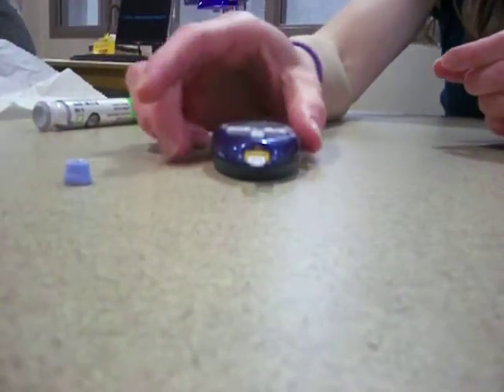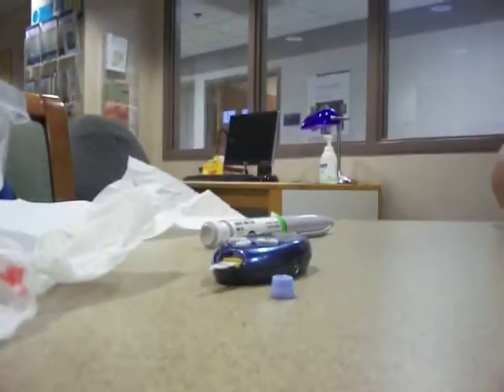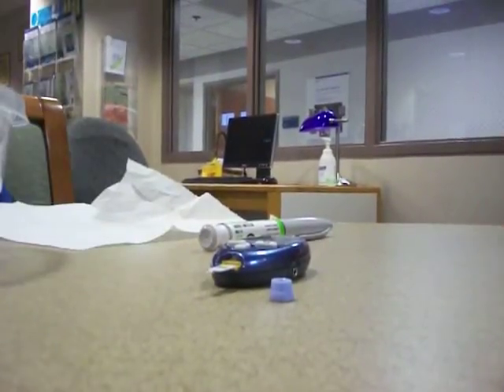You shouldn't have to wipe it this time because you already wiped your finger off once. There's a little better drop than all this. Why don't you do this one? Sticking straight up. There. That beep totally is going. I think sometimes when you're 103. Nice.